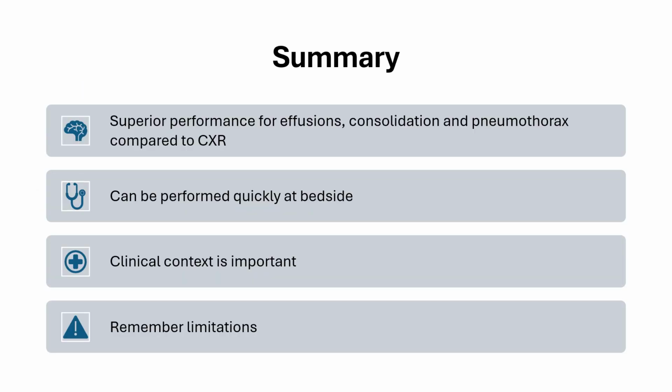So in summary, lung ultrasonography has superior performance compared to chest X-ray for effusions, consolidations, and pneumothorax. It usually can be performed relatively quickly at bedside and potentially can lead to faster appropriate interventions. Again, like with any test, clinical context is essential. Remember limitations and possible harm due to improper diagnosis.